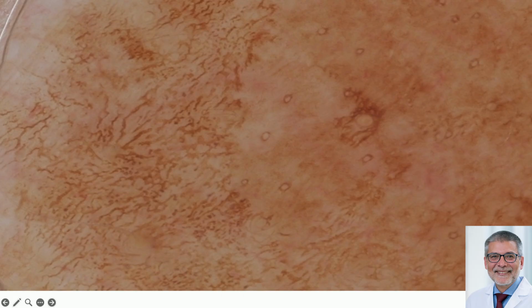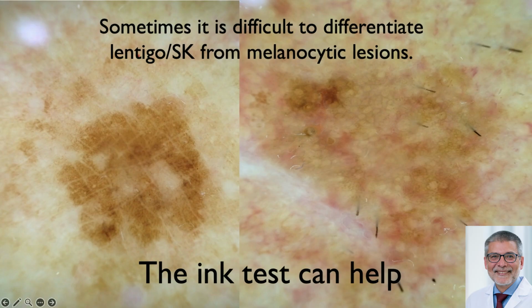Now, one of the maybe drawbacks to dermoscopy is that you have taken a three-dimensional object and converted it into two dimensions the minute you stick your scope on the skin, right? It's important to appreciate that the third dimension that you're seeing with your clinical eye is also important and needs to be factored in. And I'll give you an example of that.